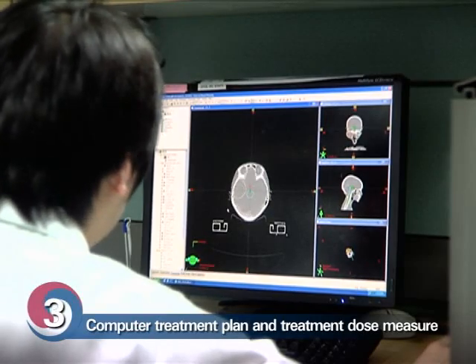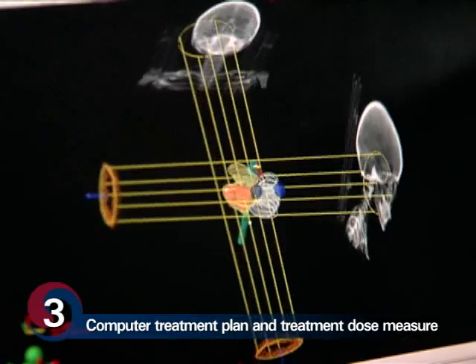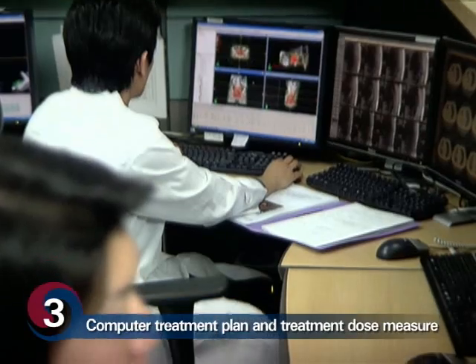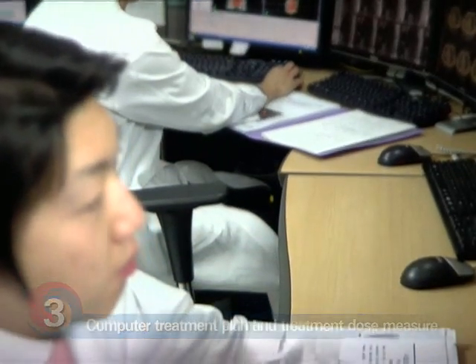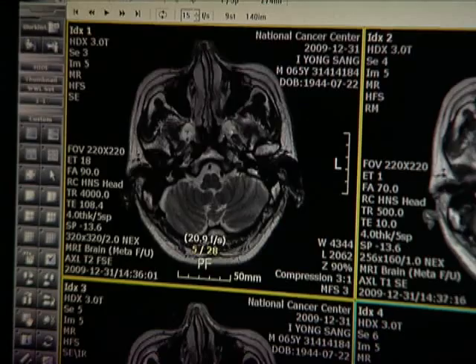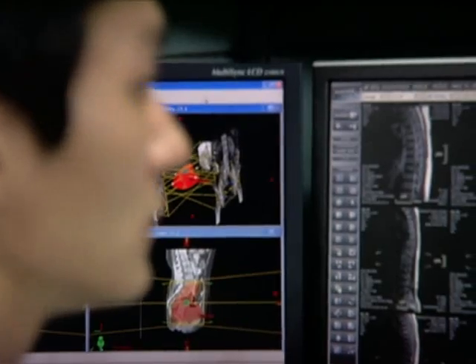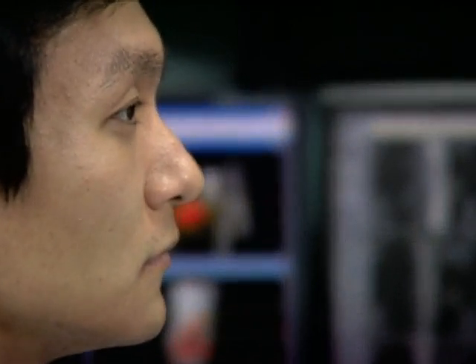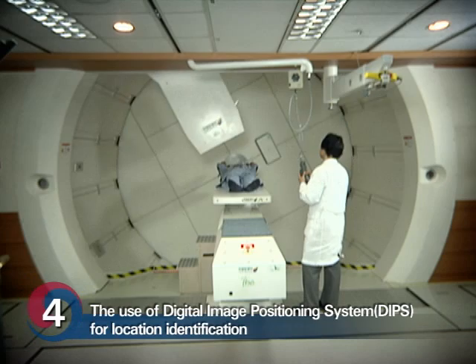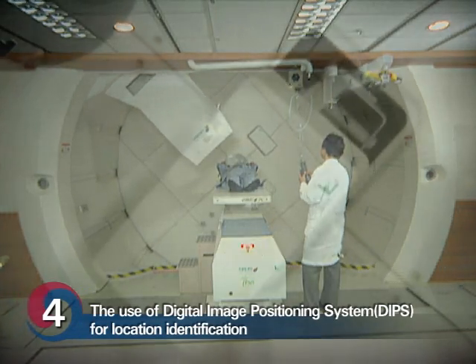Therapy is planned in the treatment planning center. It is the process of using treatment planning computers to design the ideal treatment method on the basis of the data concluded from the simulation therapy.